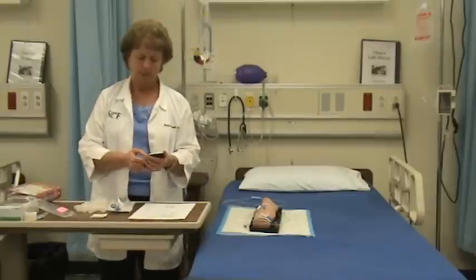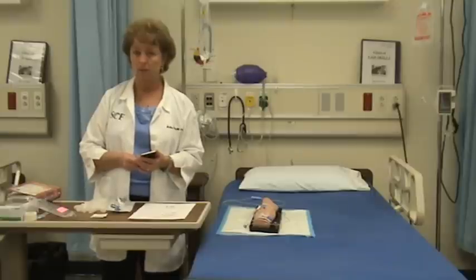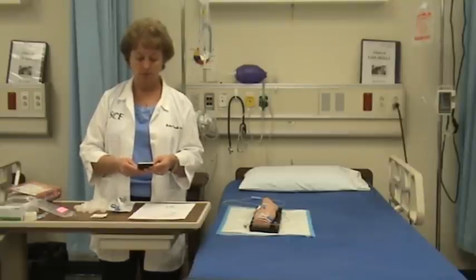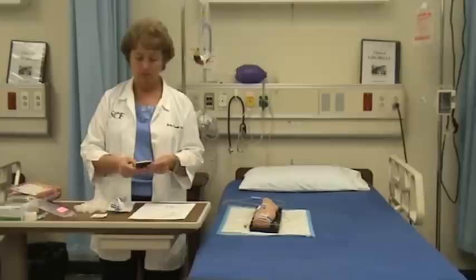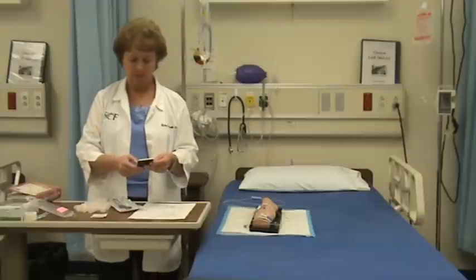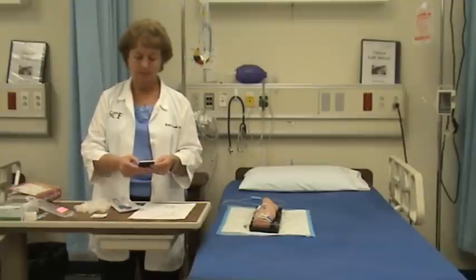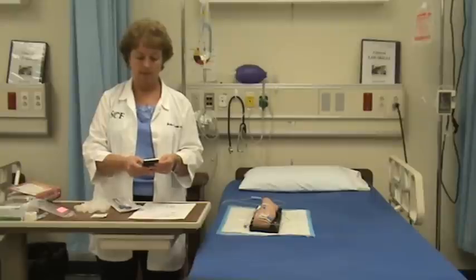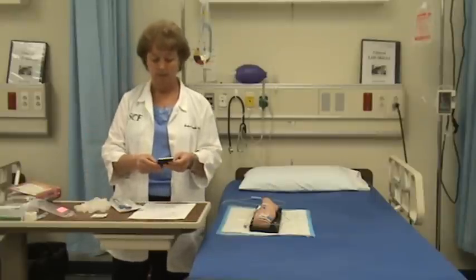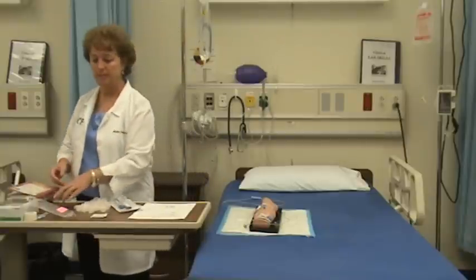I want to do my calculation for how fast I'm going to run the antibiotic. It's 100 milliliters over half an hour, so: 100 mL times the drop factor of 10 on the secondary tubing, divided by 30 minutes, equals 33 drops per minute. So I'm going to be giving it at 33 drops per minute, or about 8 drops every 15 seconds.